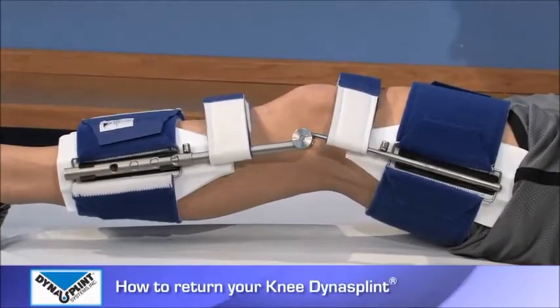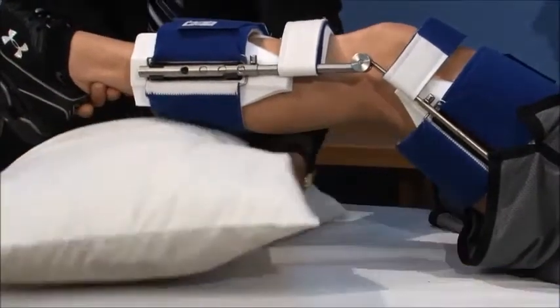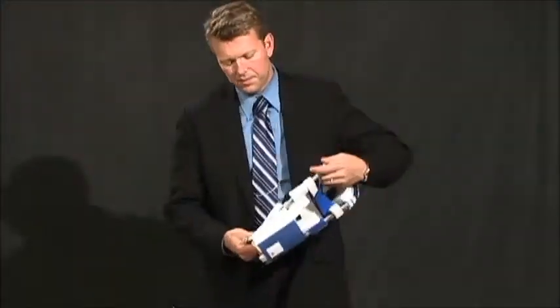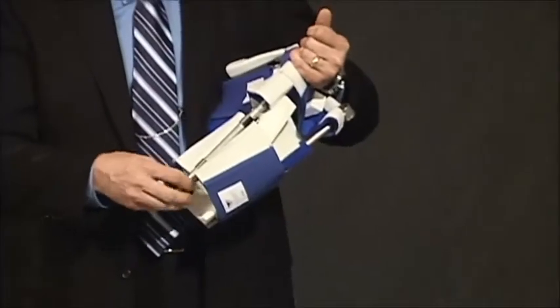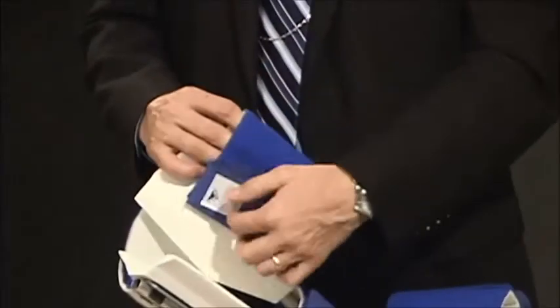Congratulations, you have finished using your Dyna Splint. We hope your range of motion goals have been achieved and you're on your way to a more functional and comfortable life. To return your knee Dyna Splint, simply use your adjustment tool to turn the tension to zero on both sides of the splint.